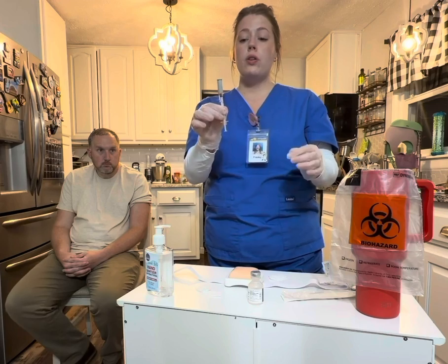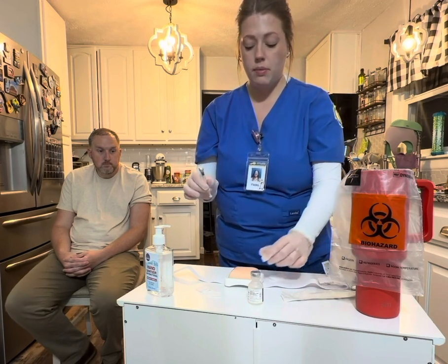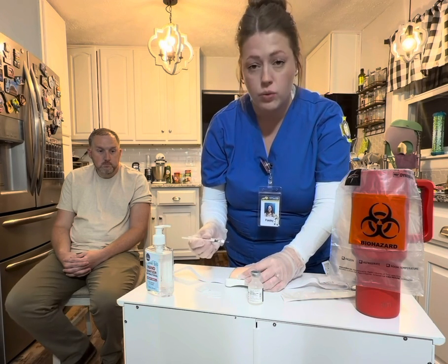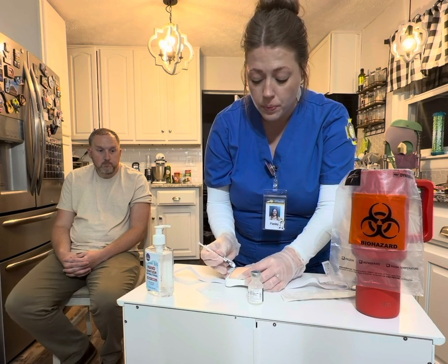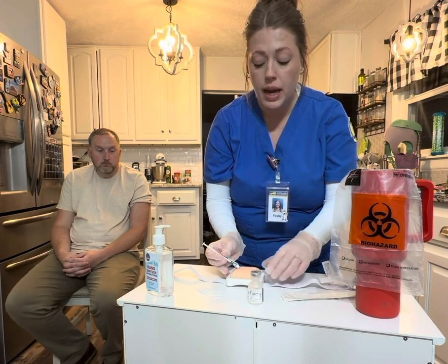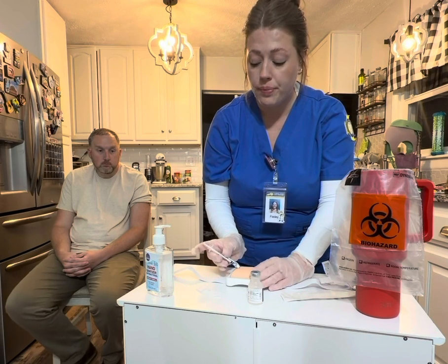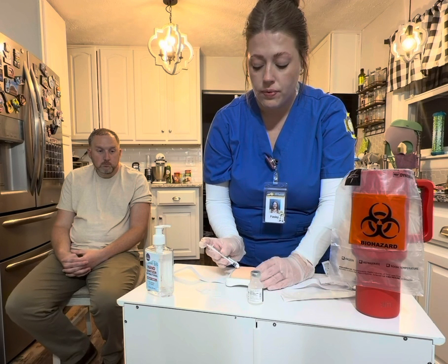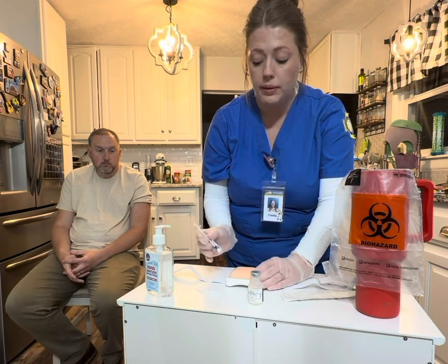So what we're going to do is hold in our dominant hand our syringe, remove the cap. Then we are going to pinch the tissue. And then we are going to go in swiftly and quickly at a 45-degree angle. And then we're going to release the tissue before we inject the medication, because you don't want to inject medication into compressed tissue. We're going to slowly inject the medication. And then we're going to come out exactly how we went in at a 45-degree angle quickly.